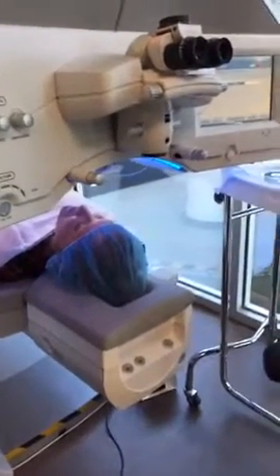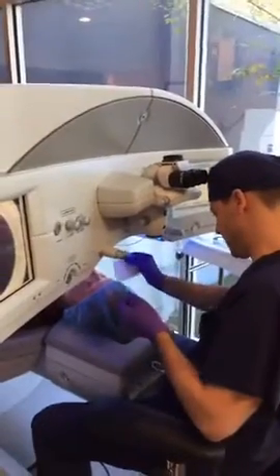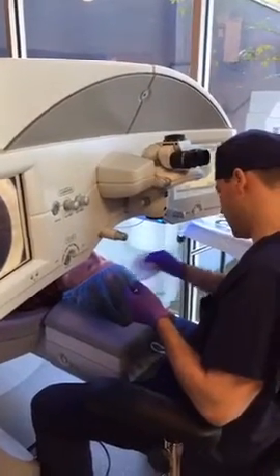It's good. I'm feeling pretty relaxed. I feel much better than I did before. That's the happy pill. Yeah. Okay, go ahead and close your eyes for a second. I'm just going to dry off that extra fluid.